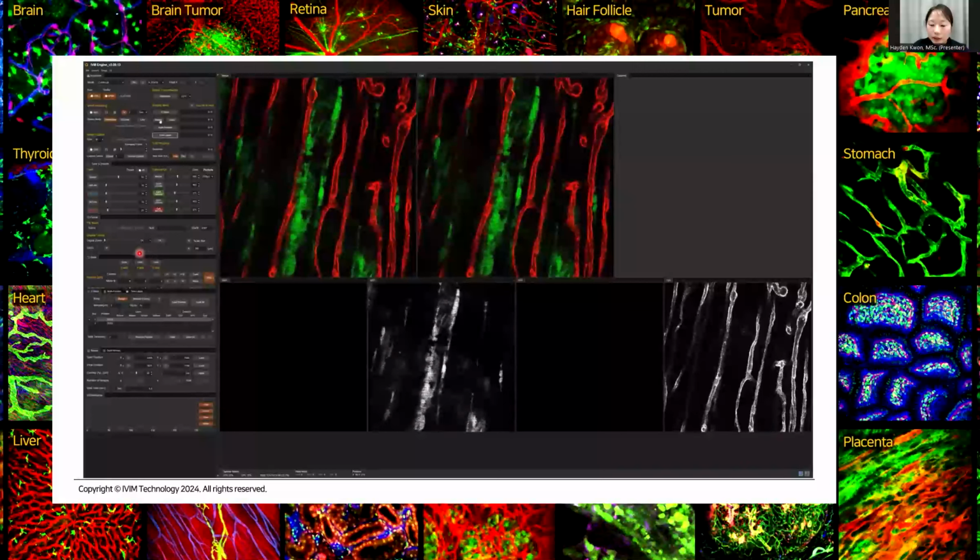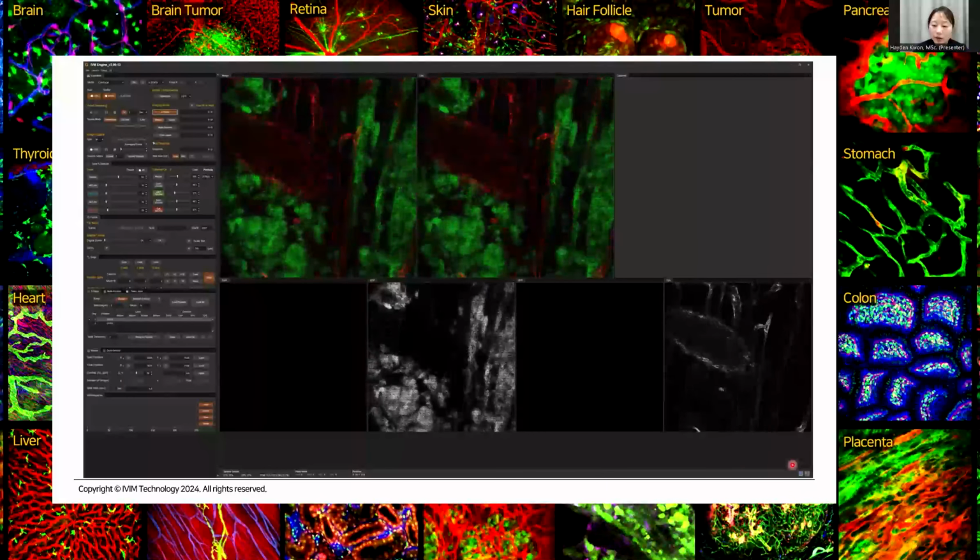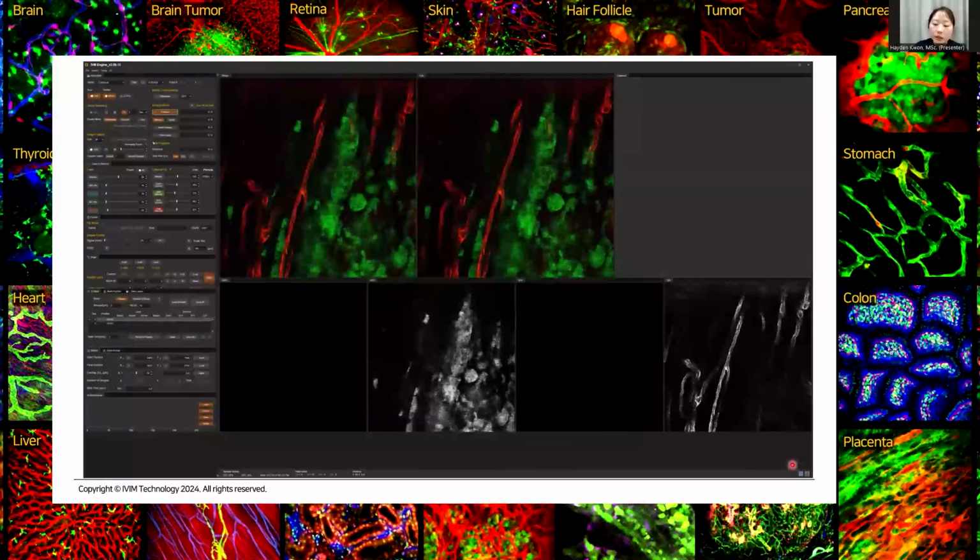For this imaging session, we will be using the mosaic imaging mode along with the Z-Stack. This approach allows us to obtain a comprehensive view of the cancer cells and vasculature across the entire depth in a wide field. To perform imaging over the desired area, we need to specify the imaging spot.